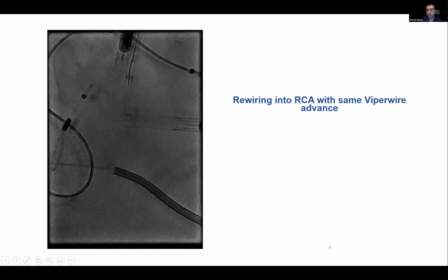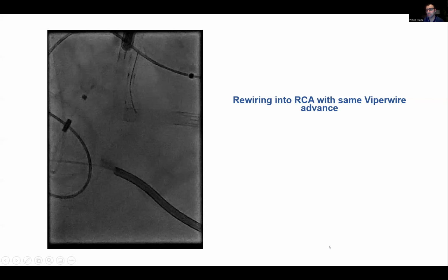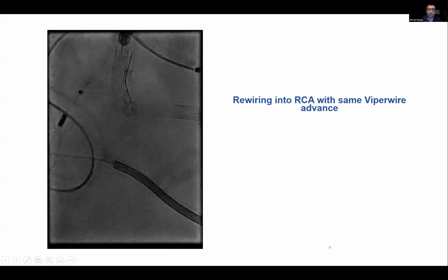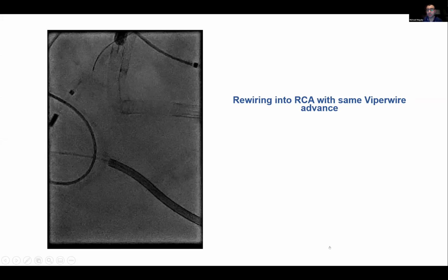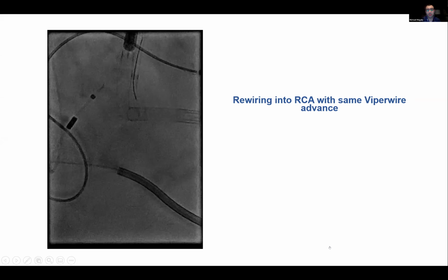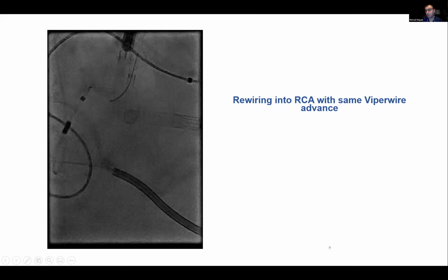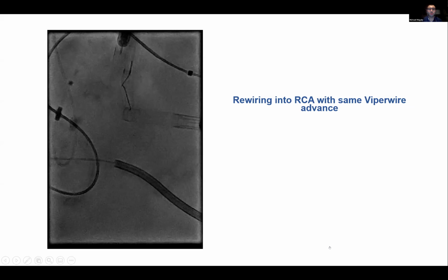We thought about putting in a microcatheter, and of course, putting a microcatheter would be better to do with rotational atherectomy than CSI. I'm not aware of reports of CSI with a microcatheter. I'm aware of reports with orbital, rotational atherectomy with a microcatheter, like a FineCross. But we thought that the distance here is enough and that we're not going to lose any of the vessels. And we opted not to use it.